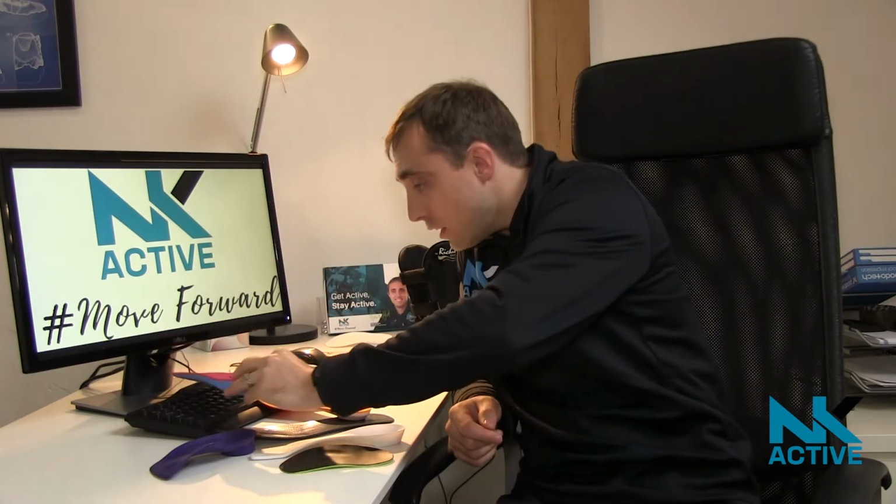Now, the big myth is that just because you buy custom foot orthoses, it doesn't mean they're going to be the best for you. With foot orthoses, it's all about getting the right tool for the right job. So there are plenty of patients we see where a simple modified off-the-shelf set of foot orthoses does the job perfectly well. And that's myth number one.